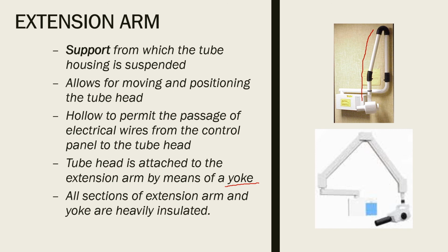The X-ray tube head is finely counterbalanced in its extension from the extension arm. So if it is left suspended for long periods, the counterbalance is upset. So that's why after we use our X-ray machines, we want to park the X-ray machine, the extension arm and the tube head against the wall with the PID pointing down to maintain the counterbalance. Because if we lose the counterbalance, then it can lead to a drifting tube head, which will lead to upset students.